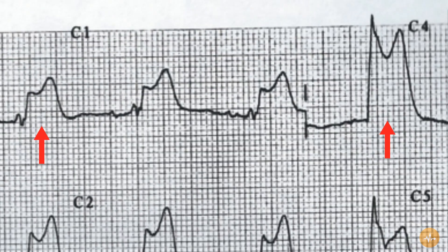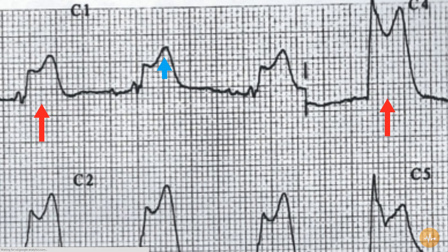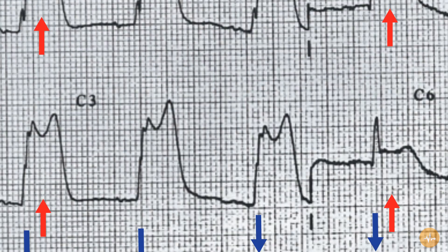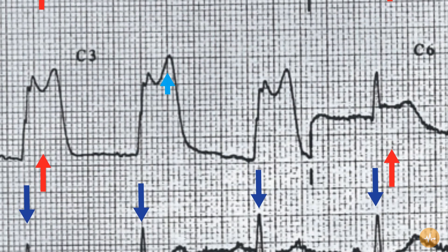The T waves could be described as hyperacute or peaked and are larger than the QRS complexes in leads V1, V2 and lead V3.